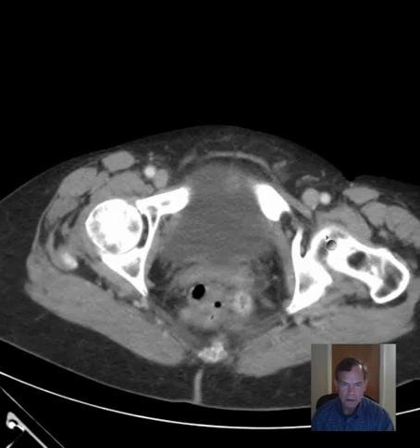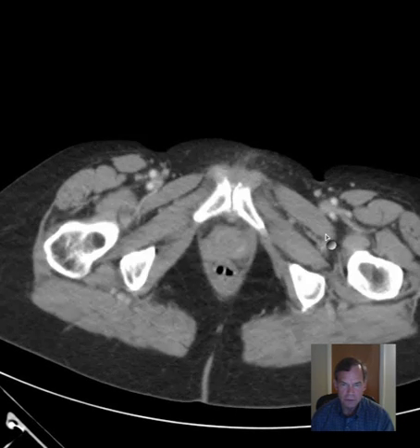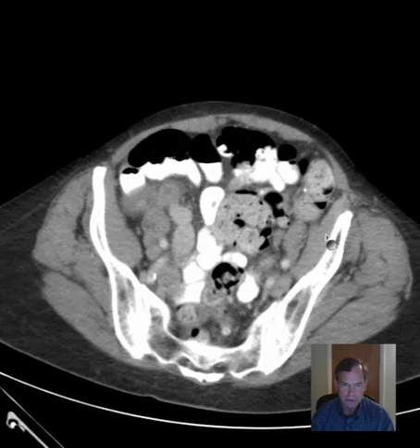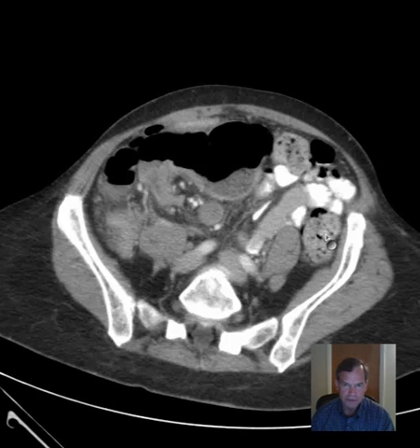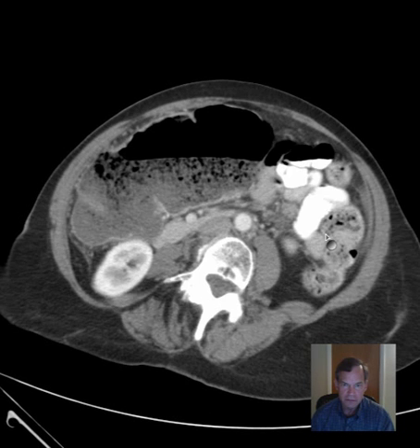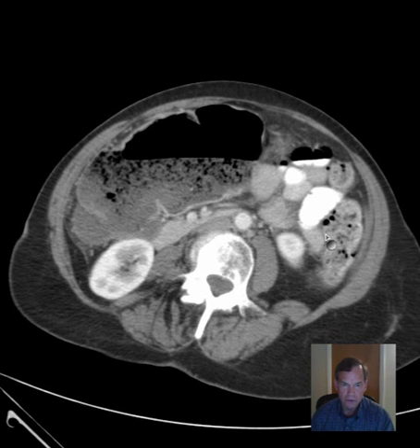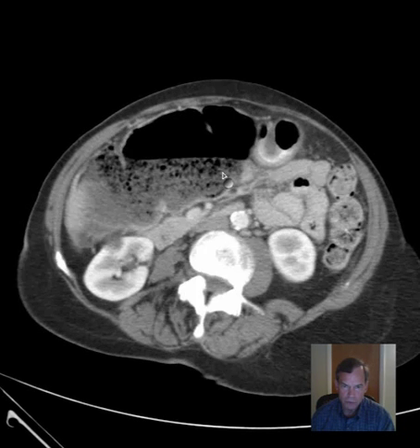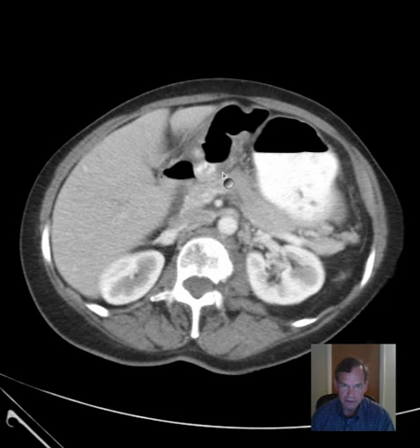Okay, that's one pass and then we'll go back up through it. There's obviously a dilated viscous, meaning a loop of bowel or segment of bowel of some sort that has debris in it. We'll get back to that.